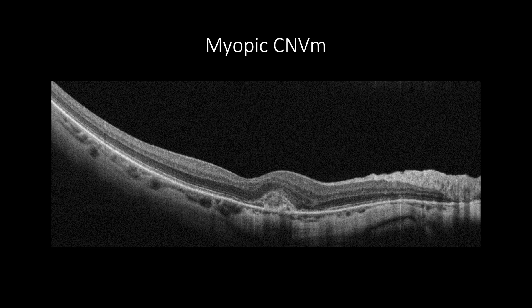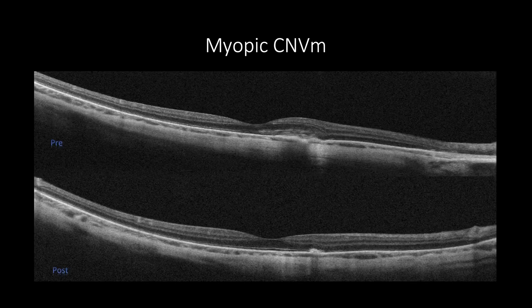Thus, OCT can differentiate subretinal bleeding from a choroidal neovascular membrane. However, this case shows subretinal hyper-reflective material with minimal subretinal fluids. OCT is important to assess treatment efficacy for choroidal neovascularization or progression on follow-up, as shown in this example where a myopic patient complicated with choroidal neovascular membrane without subretinal fluids, and the cross-section shows regression of the choroidal neovascular membrane post-treatment with intravitreal anti-VEGF agents.